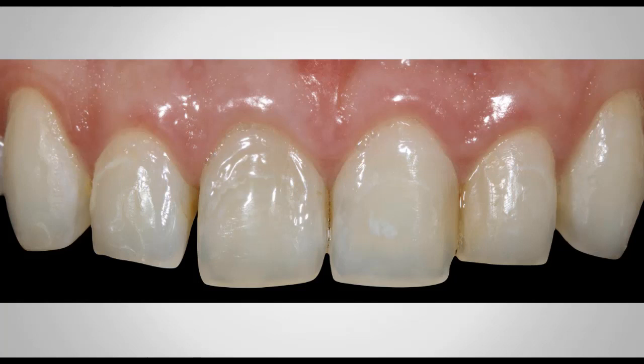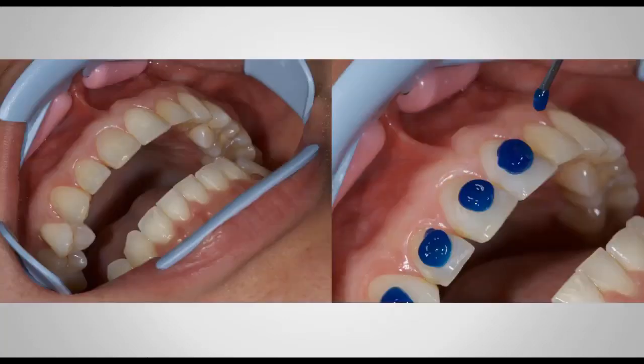I've retracted the lips. I just air dry everything, and the first thing that we're going to do is spot etch. And how much do you spot etch? Well, the answer to this question is very easy. If you plan to keep your prototype for more than a month, or 6 months, and it's only a facial one, I'm going to acid etch my entire facial aspect. I'm just going to be 1 millimeter short of the gingival margin and 1 millimeter short of the incisal edge. Those are the only two areas I don't etch. I etch everything around that area.